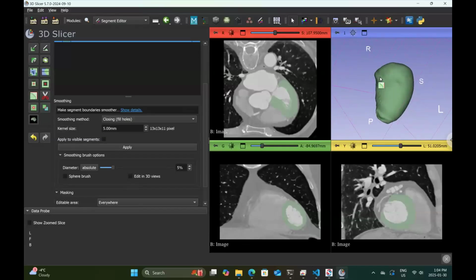Okay, are there any questions, concerns, comments, any feedback on how your segmentations are going? Any feedback for Anna and I on what to cover, what not to cover? Is our goal to do a full segmentation of the entire heart structure, not just the coronary arteries?